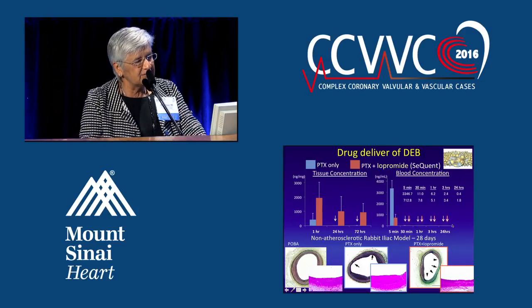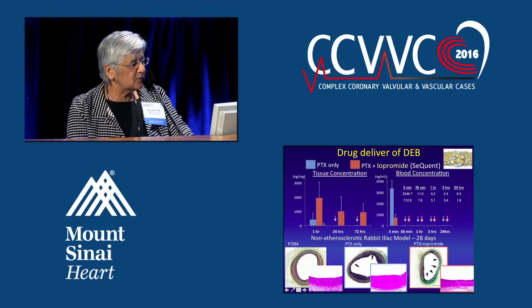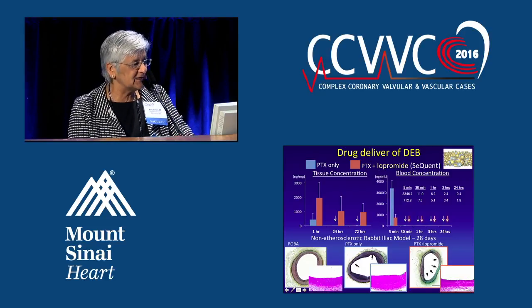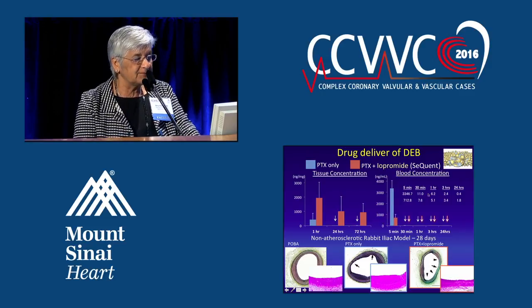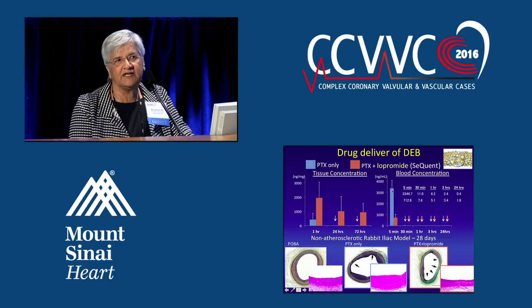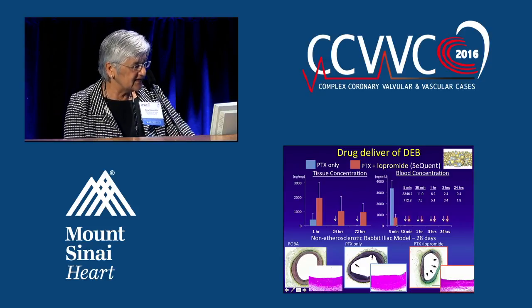But what about drug-coated balloons? If we give paclitaxel alone, tissue concentration within the arterial wall is seen only at 1 hour, and we see nothing afterwards. Whereas if you have an excipient like iopromide in the case of the Sequent Please balloon, you can see very well that drug is present up to 3 days and longer. And if you look at blood concentration, you see very high levels when you give just paclitaxel without anything, whereas if you give it with iopromide, the levels are much lower because the drug stays in the arterial wall.